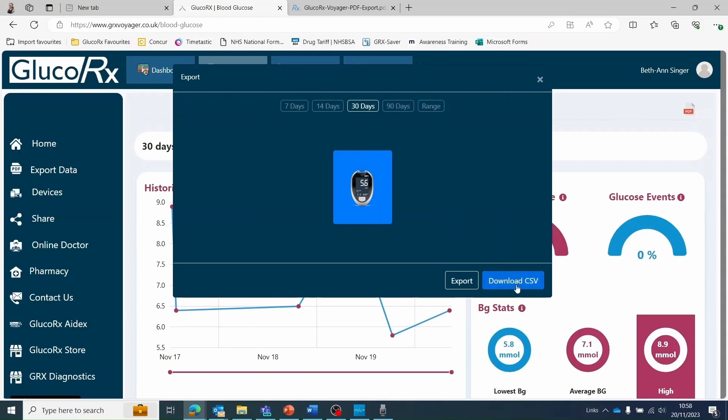You can create an Excel document by selecting download CSV or a PDF report by selecting export. The PDF report will include the information on your blood glucose dashboard, not just numerical readings, so this is normally the preferred method.